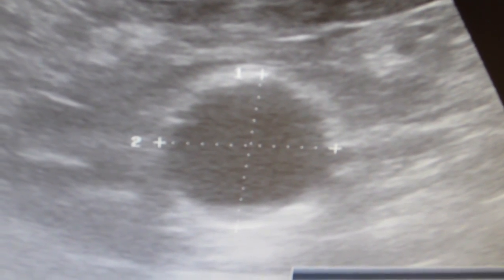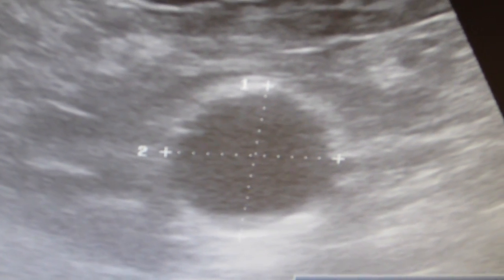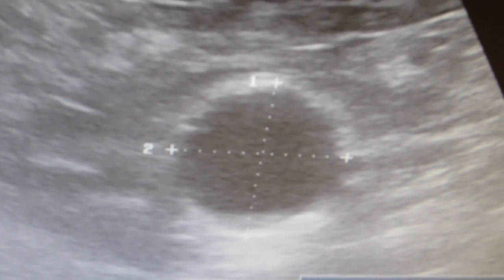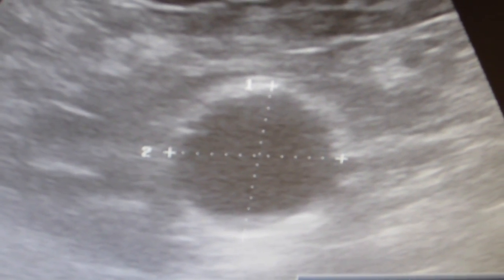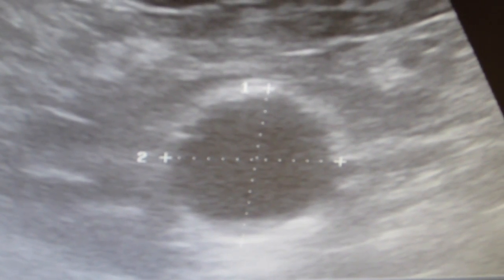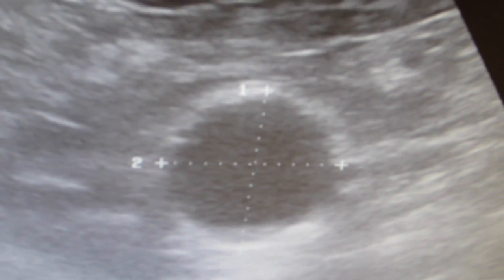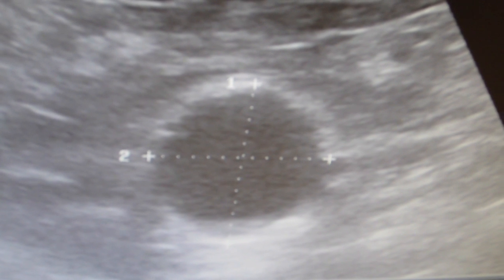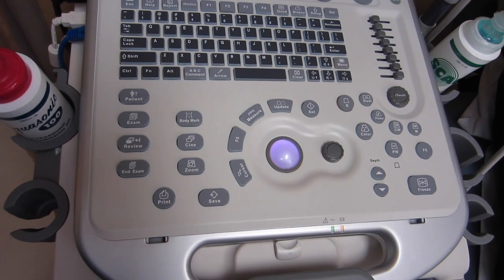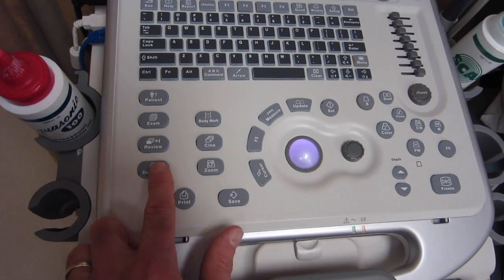Things such as calcification of the wall can sometimes blur the lines of the wall and sometimes make it appear as if there's thrombus inside of the aorta. For this specific study, again, all you have to do is measure from outer wall to outer wall. However, if there is concern or if you are unsure about your measurements, you should refer out for an official AAA screening study. When you're done with the exam, press the End Exam button in the lower left-hand corner.